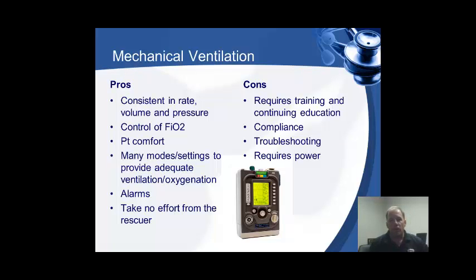So, the ventilator, there's a good picture of it. Kind of shows you what you're dealing with. Got a lot of buttons on it, a lot of knobs. What's so great about it? Well, it's got a lot of variable settings to help make your patient comfortable and make sure that they're ventilated properly. You can give a consistent rate, volume, and pressure, and you can control your FiO2 a lot better than we could on the old vents.